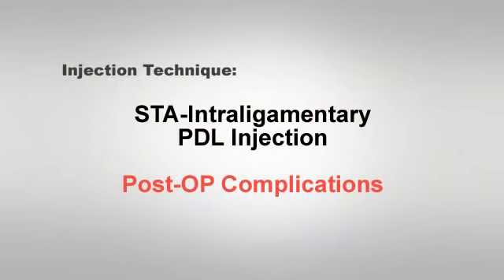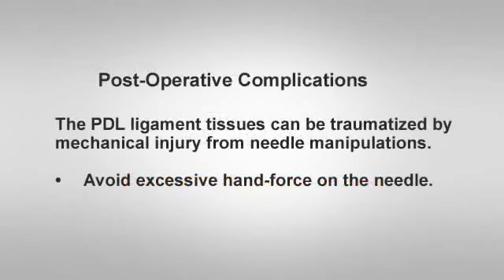Post-op complications. There are 3 primary reasons for post-operative discomfort from the PDL injection. These are: first, the PDL ligament tissues can be traumatized by mechanical injury from needle manipulations. It is important not to use excessive hand force when placing the needles into the PDL space. Wedging or forcing the needle into the PDL space can cause post-operative discomfort.